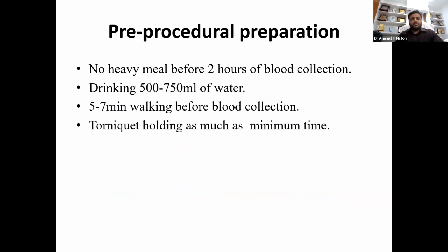Another very important thing is the pre-procedural preparation. Many times the patient is in a resting condition, just waiting for care, so there is no work. They sit outside the chamber for half an hour or 1 hour. So it is the rest condition.